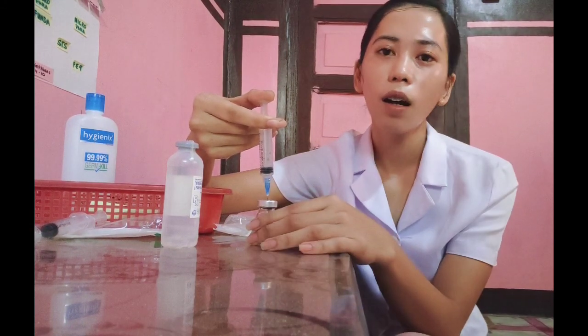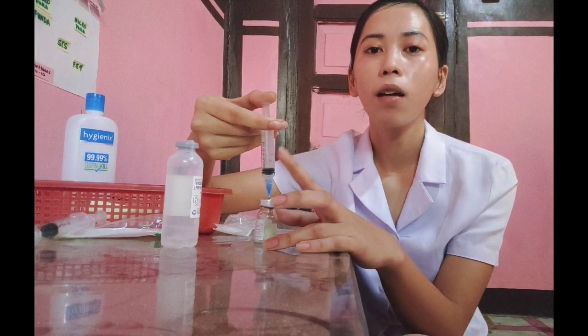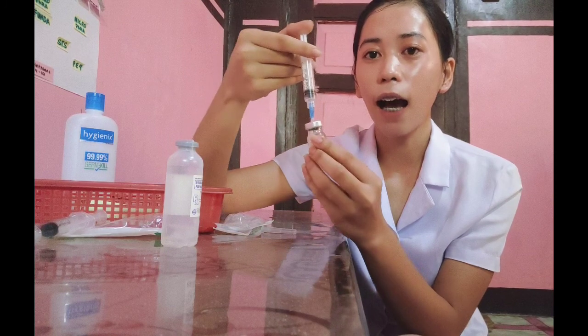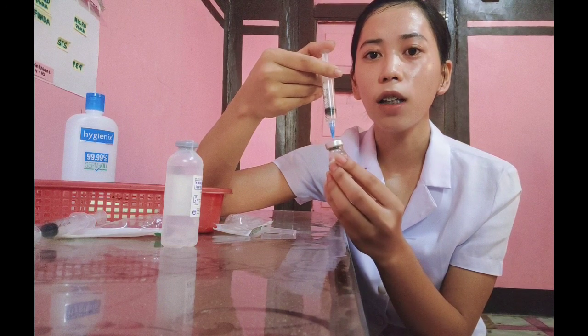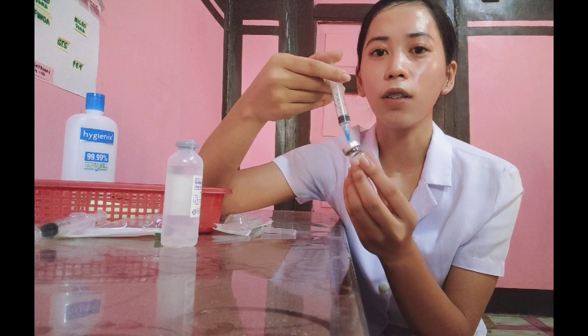And then withdraw the prescribed amount of medication using either of the two methods. Then hold the syringe and vial at eye level to determine that the correct dosage of the drug is drawn into the syringe.